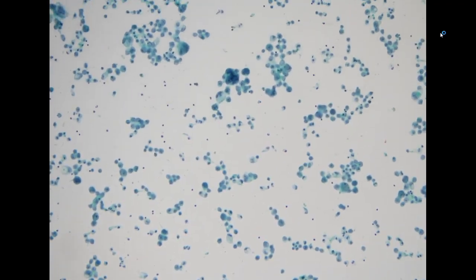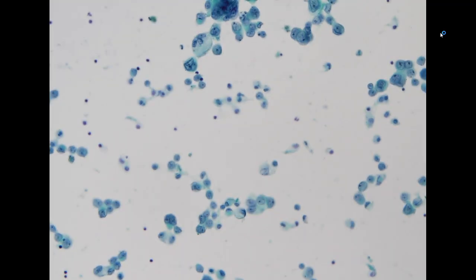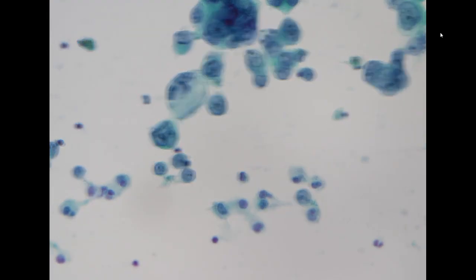Back to one of our most common specimens. This is from pleural effusion. The patient has lung cancer and has been treated. These are very high-grade adenocarcinoma.